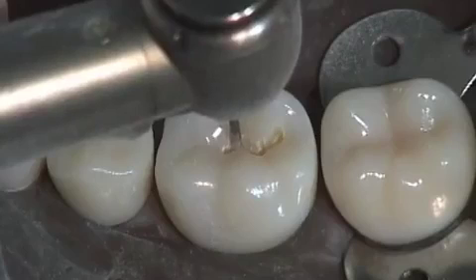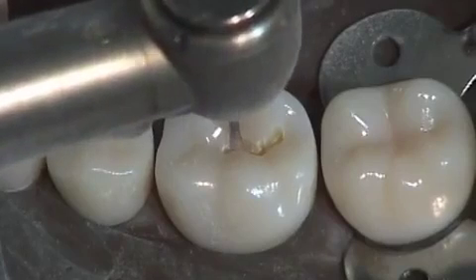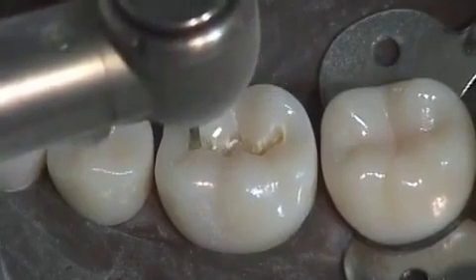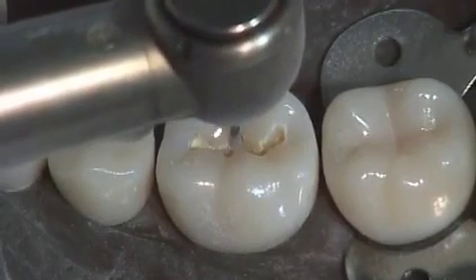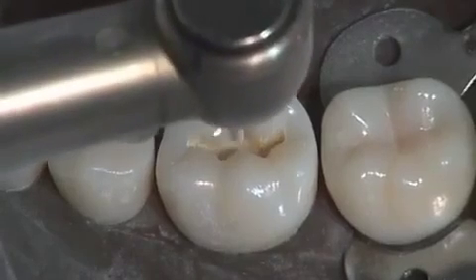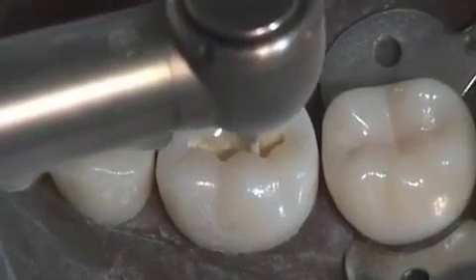A good guideline is to drop somewhere between half and full length of a 245 burr, which is just shy of 3 millimeters in length. This will put you just inside the dentin layer on an average occlusal surface.